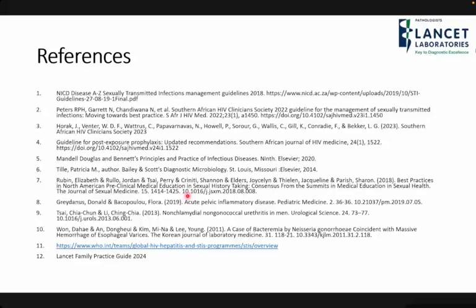The only places where I know we do PCRs, and it's PCRs for Neisseria gonorrhoeae and chlamydia, are tertiary hospitals. I trained in Steve Biko, and we do have PCR for chlamydia and gonorrhea, but the whole multiplex panel is not feasible because it is very expensive.